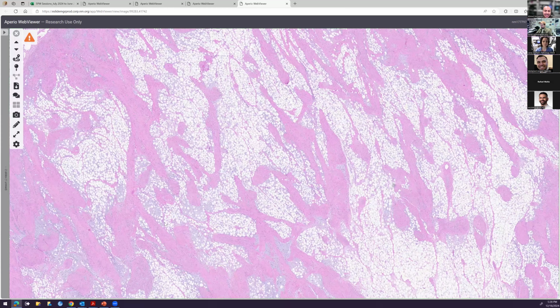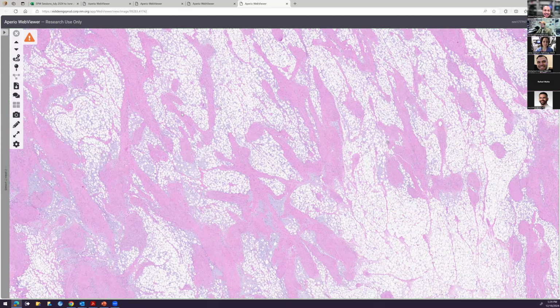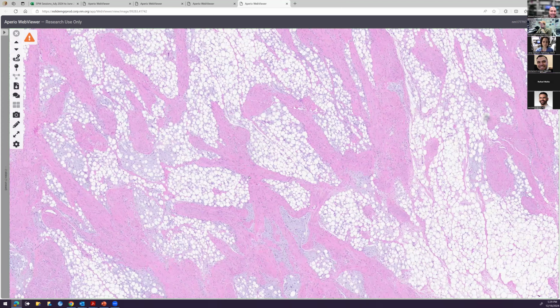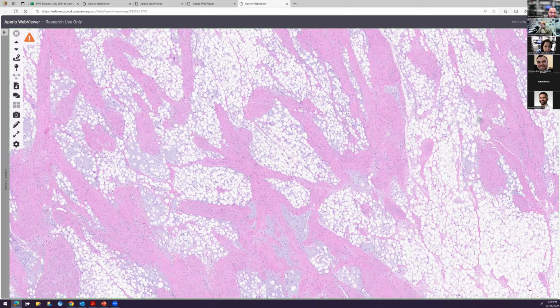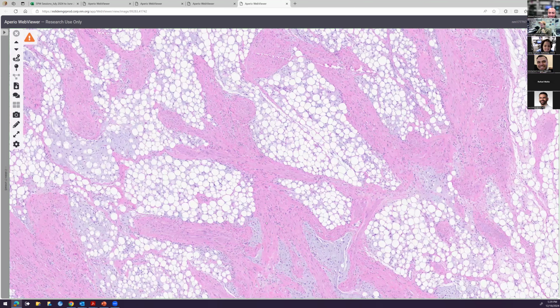What is all this stuff here? It looks like we have a lot of myxoid change. I agree, there's myxoid change. That's true. What about this stuff, the big pink stuff here? It looks like fibrous septae. Yeah, it looks like a part of the lesion. It doesn't look like part of the normal wall. Weird, right? Big, weird fibrous septae. Okay, cool.